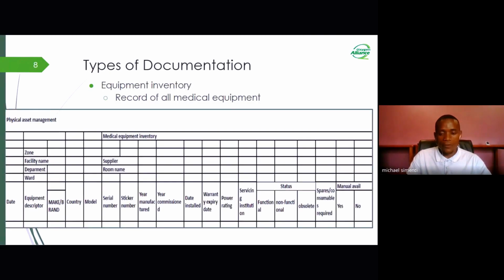The other type of documentation is the equipment inventory. I'm sure that just by mentioning inventory, it pops up in our minds, like, I've heard about this, right? When we are talking of inventory, this is the mother of all documentation which can be done in an institution or health facility, because it takes all information about the medical equipment or devices which you might have in your institution, right?